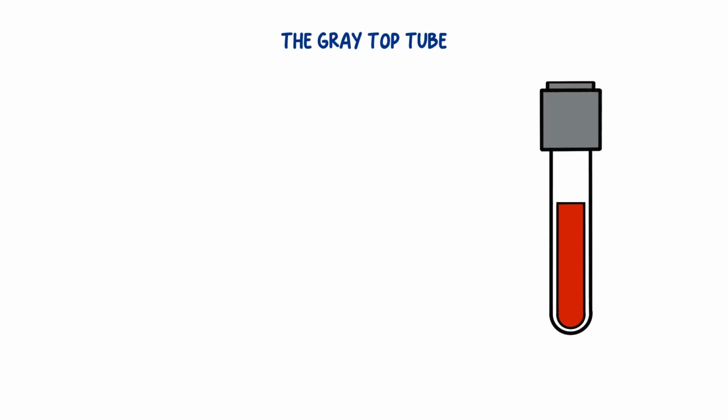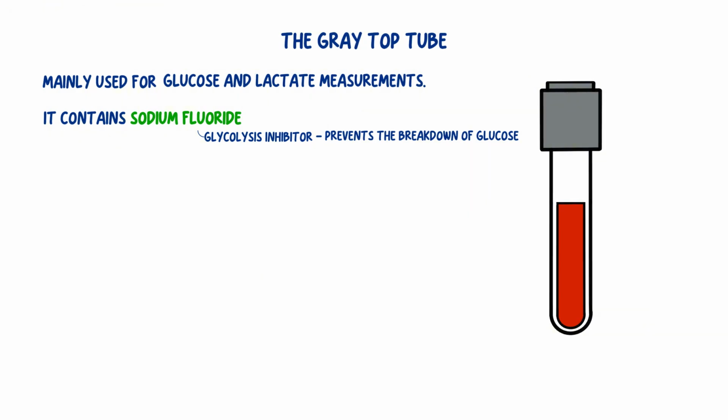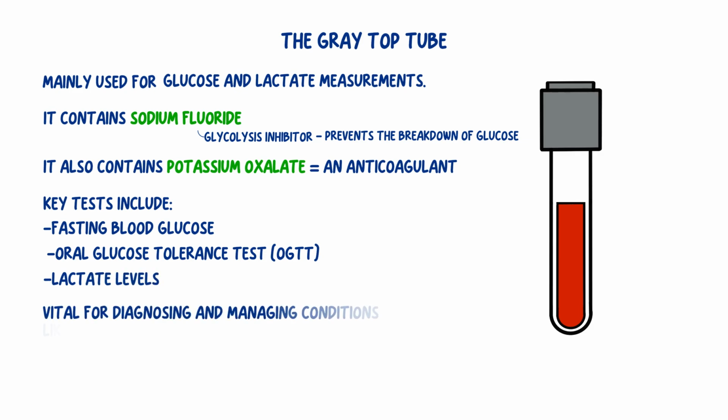The gray top tube is easy to remember because it is mainly used for two important tests: glucose and lactate measurements. This tube contains sodium fluoride, which serves as a glycolysis inhibitor, effectively preserving glucose levels by preventing the breakdown of sugar in the blood sample. Additionally, it contains potassium oxalate, an anticoagulant that binds calcium, preventing the blood from clotting. The gray top tube is essential for key tests such as fasting blood glucose, oral glucose tolerance test, and lactate levels. These tests are vital for diagnosing and managing conditions like diabetes and lactic acidosis.